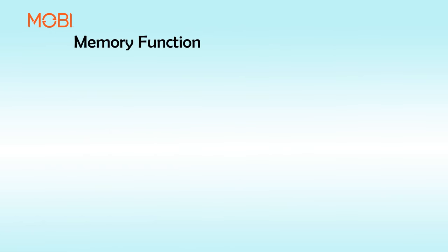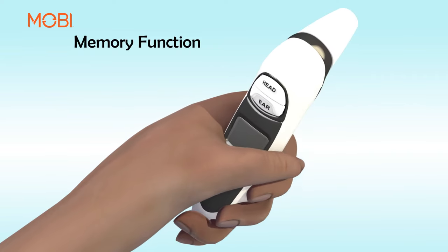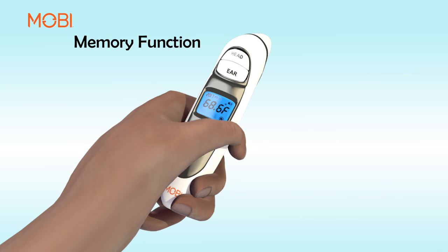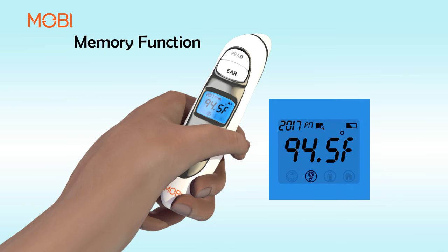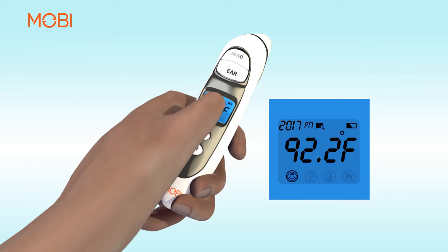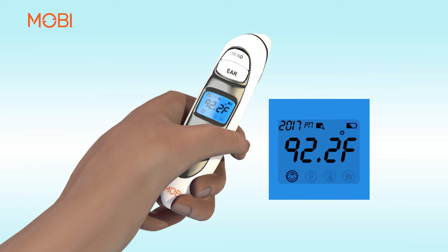Memory Function. You can recall up to nine prior measurements stored in memory. Turn on the thermometer. Press the MEM button once, and then press it again to show the last measurement. The symbols for ear, forehead, and food will appear with each measurement stored in memory to indicate whether a person's forehead, ear, or food temperature was taken. Each press of the same button recalls a previous measurement.